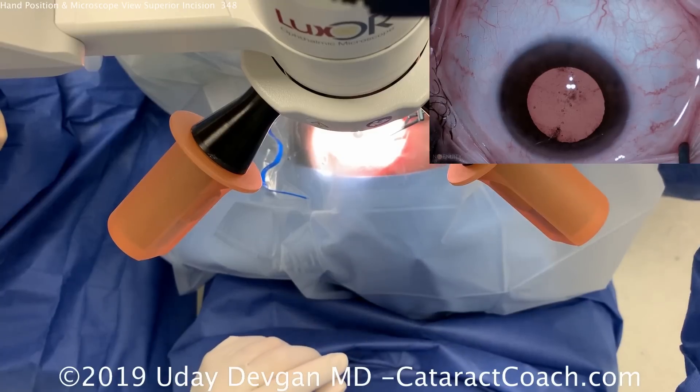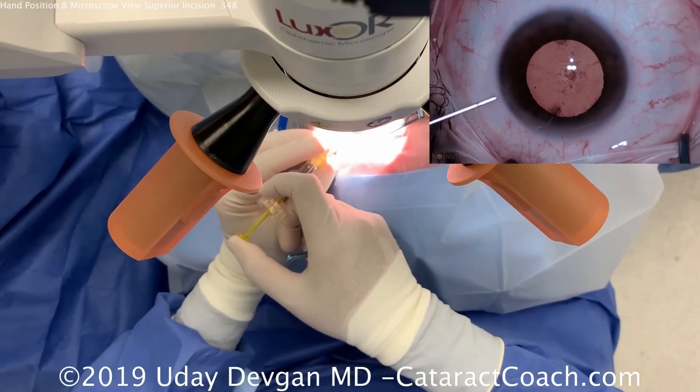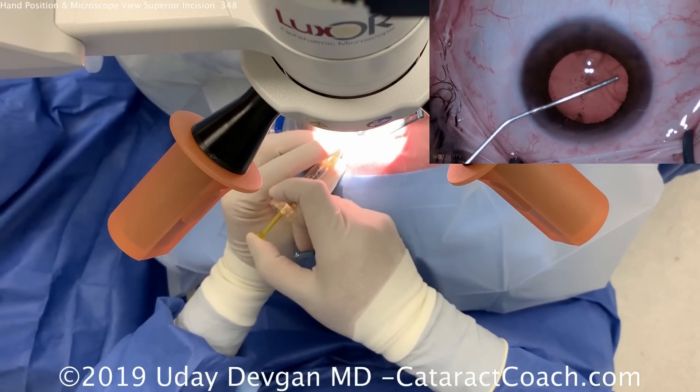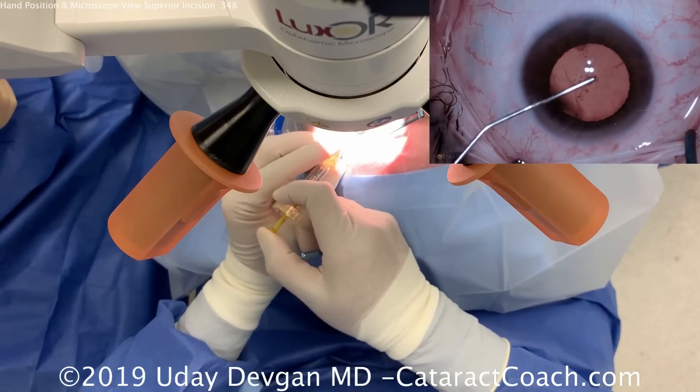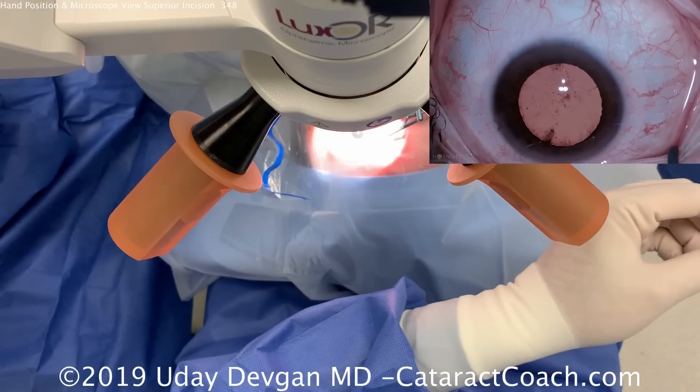This patient takes Flomax and has a pupil that may come down during surgery. For the viscoelastic, the left hand is holding the cannula tip and the right hand is on the plunger. The instruments are held like pencils — left hand pencil, and if holding it in the right hand primarily, right hand pencil as well.